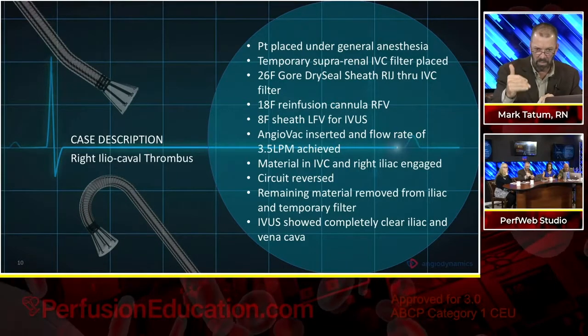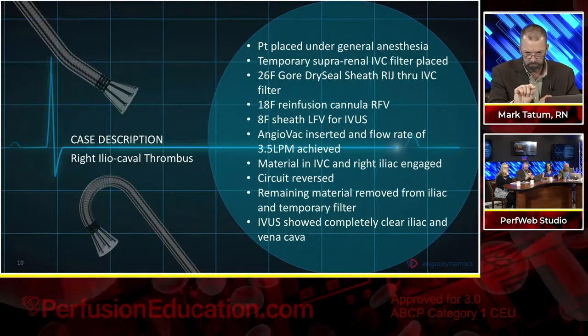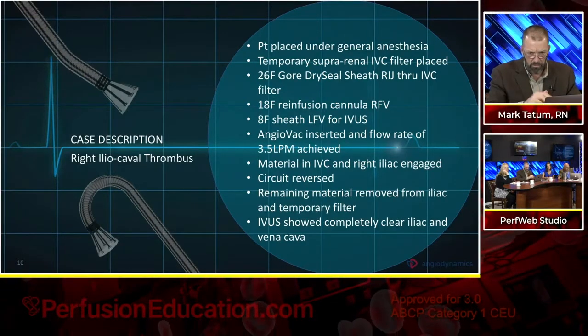I am going to mention the last thing. Everybody's had plenty of time to read this setup. The IVUS showed completely clear.